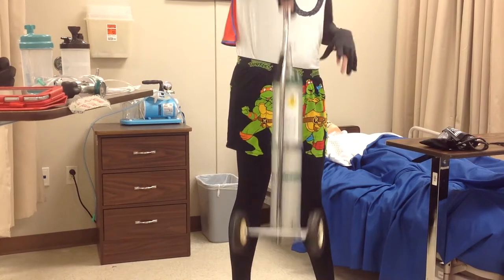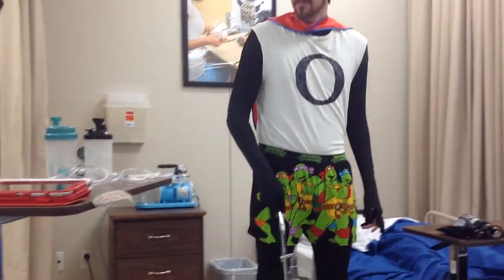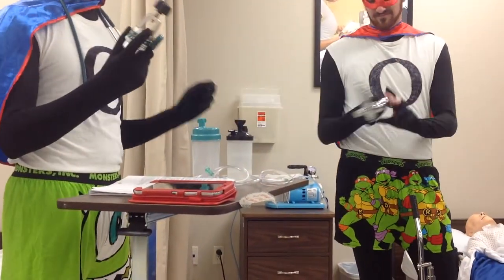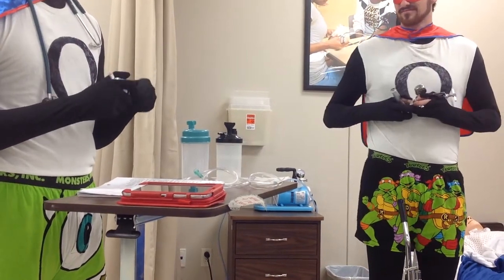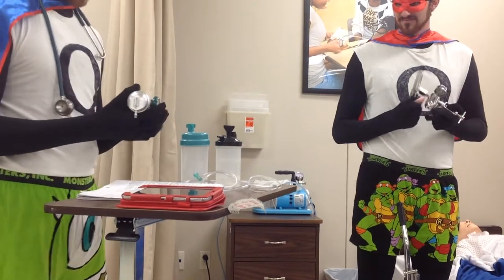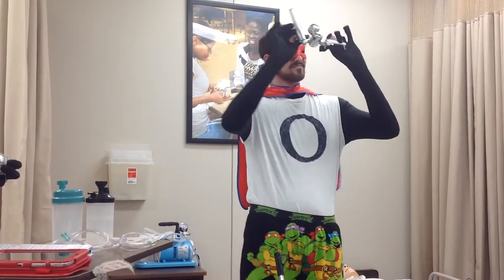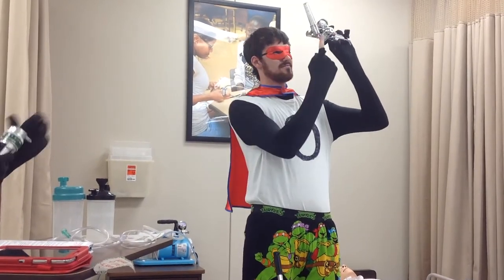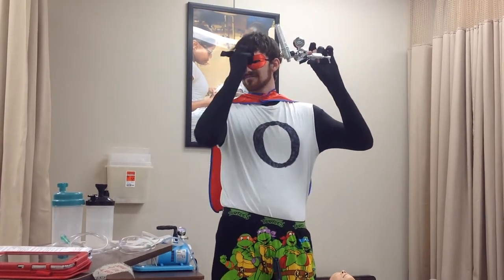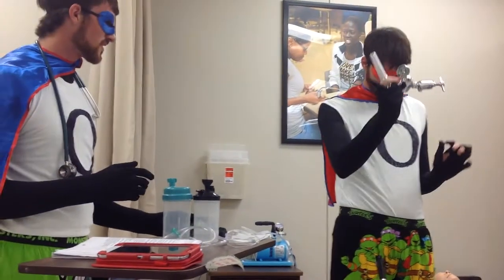Also, when you put a regulator on, there's just two kinds. You have your simple one, and then one that's a little more complex. The simple one only goes up to about 5 liters of oxygen. So if you have to give 6 or up, you'd have to use another regulator. That one goes up to 15, and it also has an adapter for humidification. With these regulators, you can also use a wall mount and attach them to a wall in a patient's room.